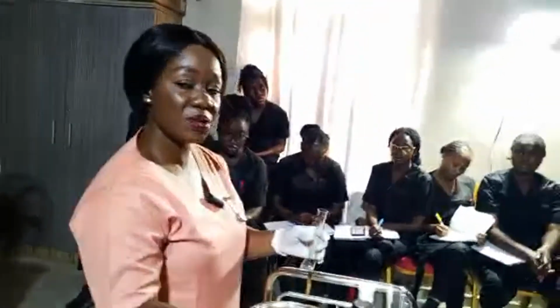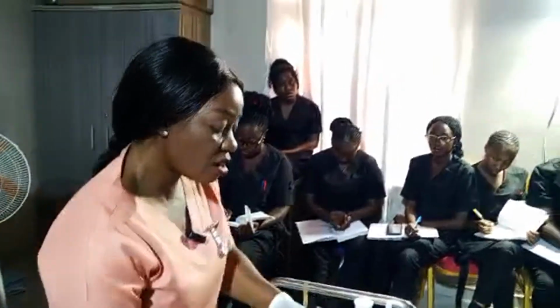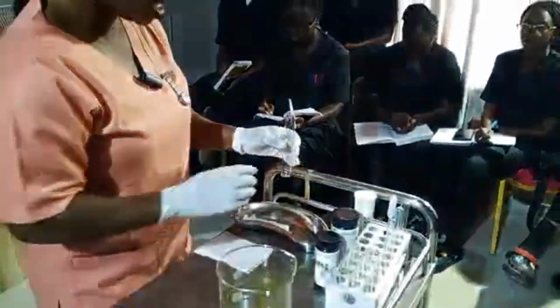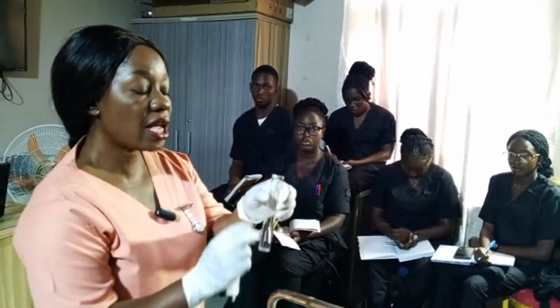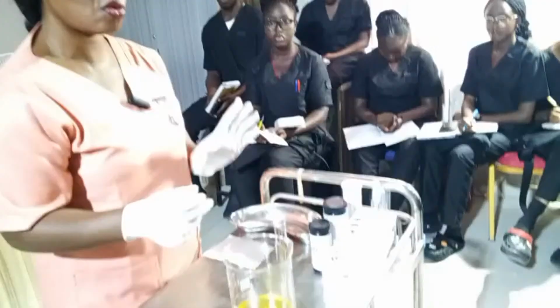The next thing now is for us to take the beaker. You can turn it this way directly into the beaker, and also you can use syringe to withdraw. Do you understand? So make sure that the test tube has a flat basement so that you can place it on a flat surface.